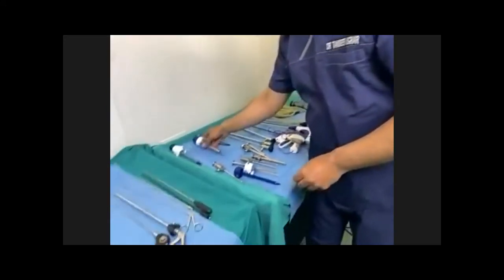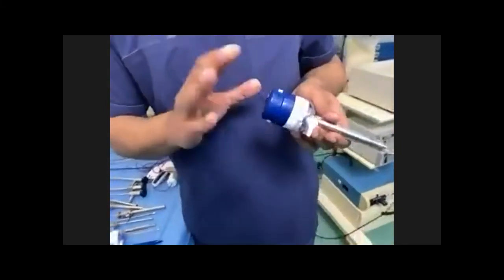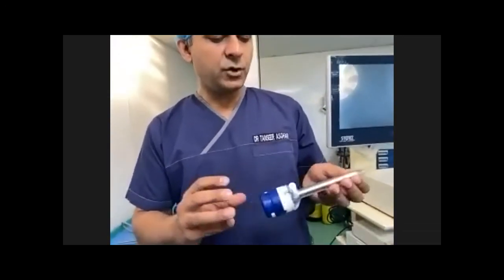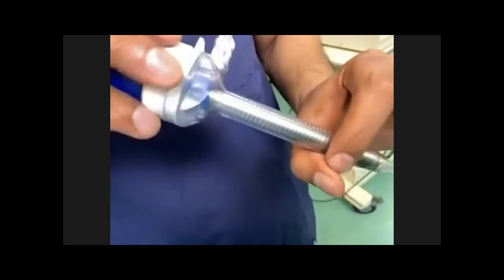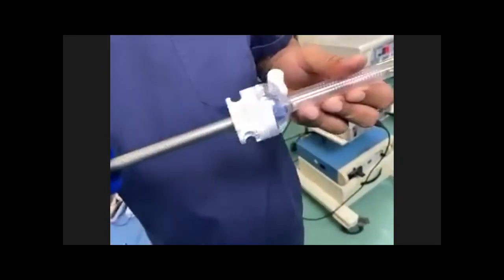Okay, coming on to another trocar. This is the same disposable trocar. The superiority of this trocar is that it is an optical trocar, optiport. So you can put the camera, the telescope, in, and you can see the muscles and different layers of the abdomen being cut. The rest of the mechanism is exactly the same.